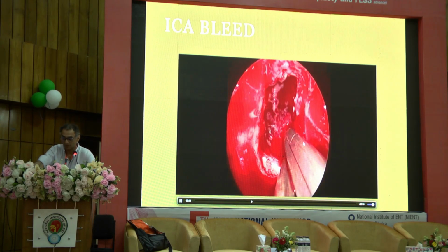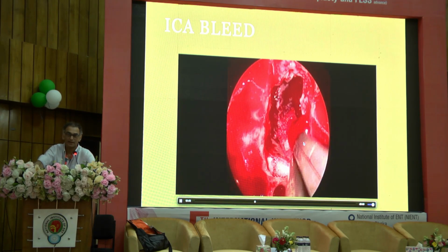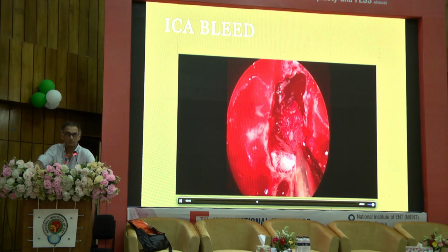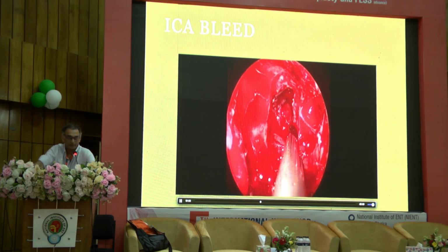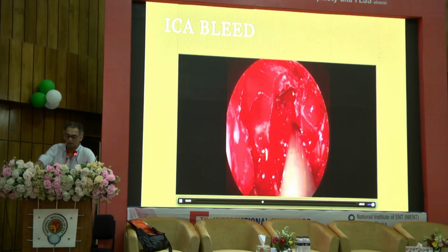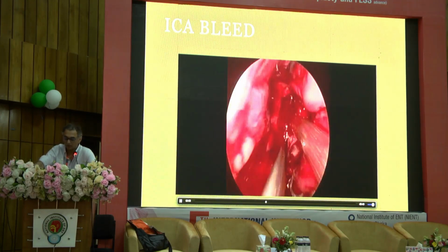This was during actually live surgery. We were at a workshop demonstrating surgery. So we already had Floseal ready. Somebody in the audience suggested we try and use Floseal. But you see that movement of that patty for a second, and the blood starts again. The person taking muscle was not so experienced, so he was taking a little time. So we said, okay, we'll try the Floseal.